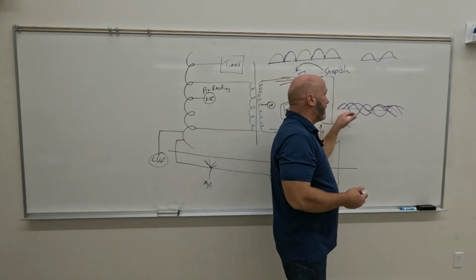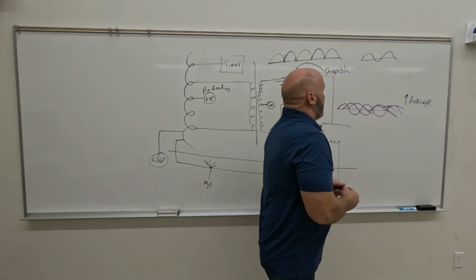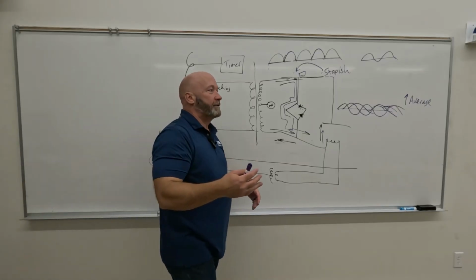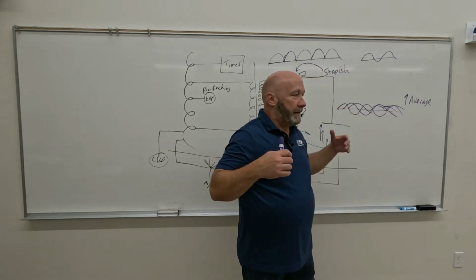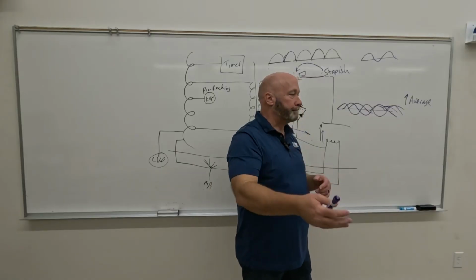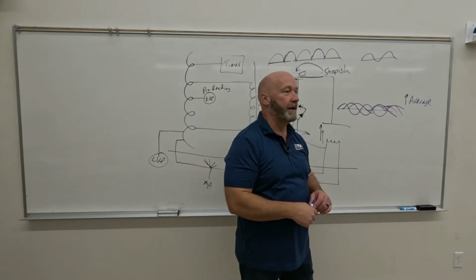So what we get off of three phase is a higher average X-ray beam. For our purpose, a higher average kilovoltage. When we create kilovoltage, we tend to think of kVp. We make kVp, and every photon that comes out of the X-ray tube is that peak energy, and it's not. And we'll talk about that later in the semester.